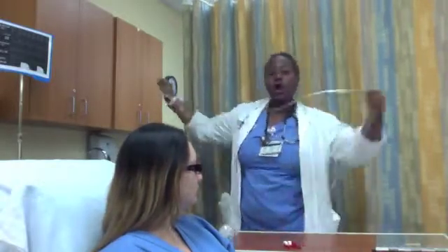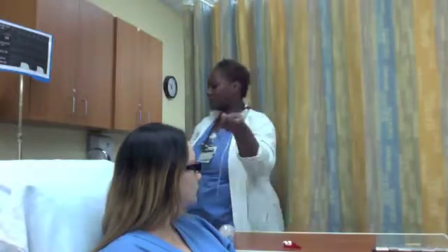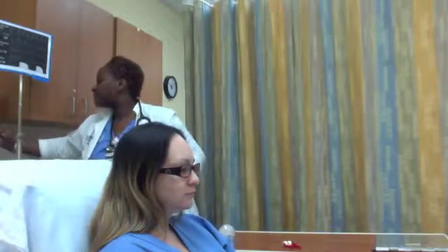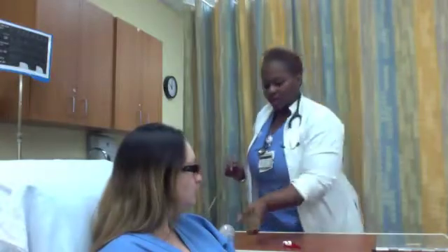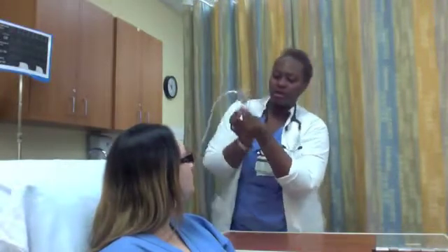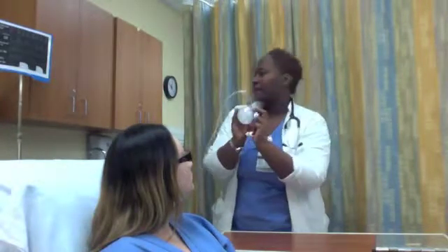Now I'm going to assemble my equipment. You're going to need your oxygen tubing and an oxygen source. I'm going to make sure that my flow is set at 5 liters per minute. This is my EasyPAP — this is my mouthpiece, this is my pressure manometer, and this is my nose clip. Because I'm using a mouthpiece and not a mask, I want to make sure that there are absolutely no leaks. I set my pressure manometer at about 10 centimeters of water pressure, and my oxygen source is set at 5 liters per minute.